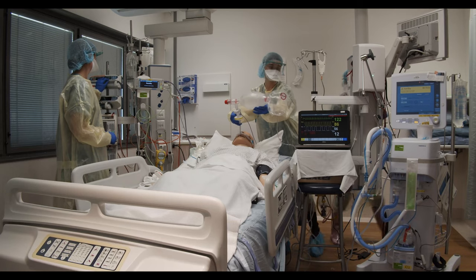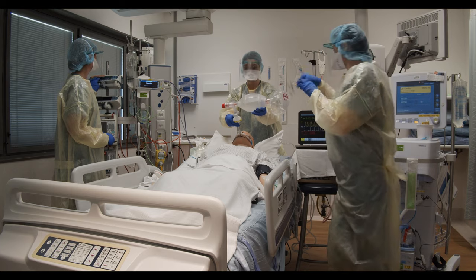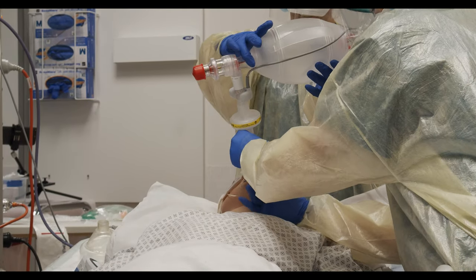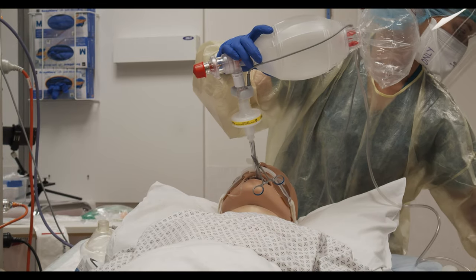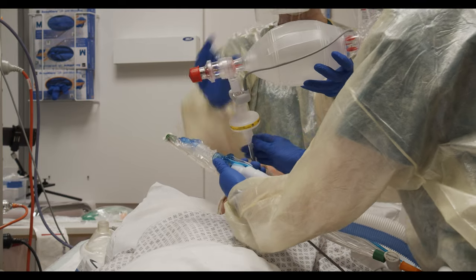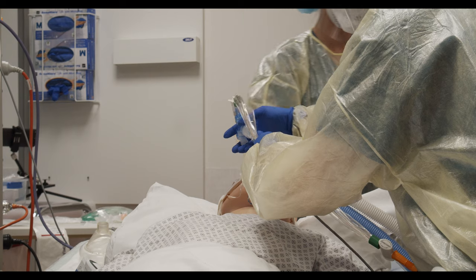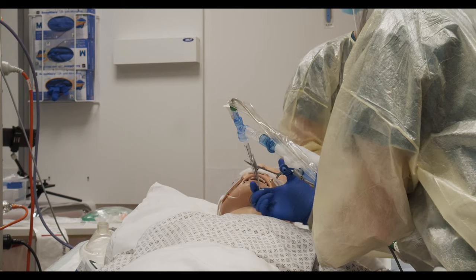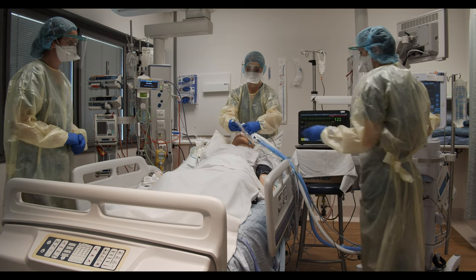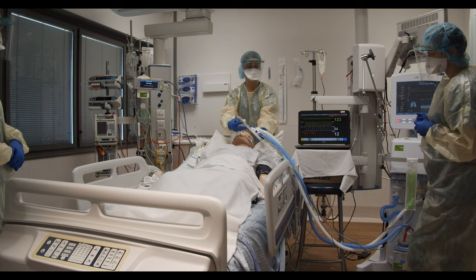Once the ET tube is secured, prior to disconnecting the ambu bag, it's important that the airway assistant then clamps the tube. The oxygen can then be turned off at the ambu bag supply. Clamps there. Okay, oxygen off. And the ambu bag disconnected from the ET tube before connecting to the ventilator circuit, removing the clamp and starting ventilation. At this point, it's important to remember to disconnect the CO2 monitor from the ambu bag cuvette and clip it directly onto the cuvette attached to the ventilator circuit.